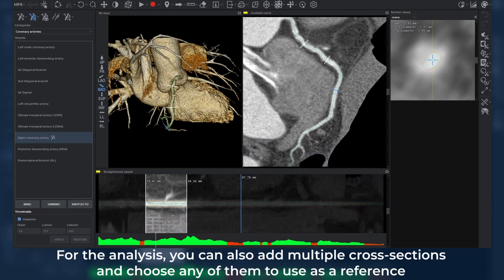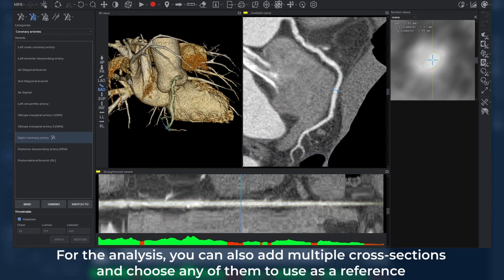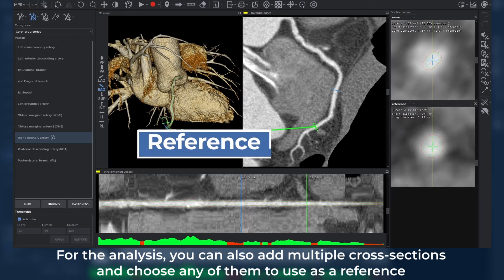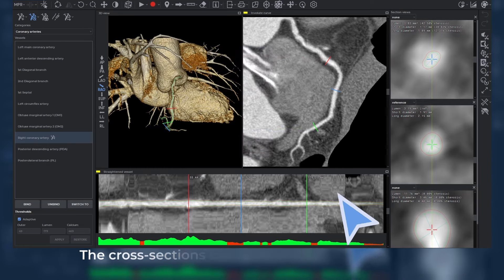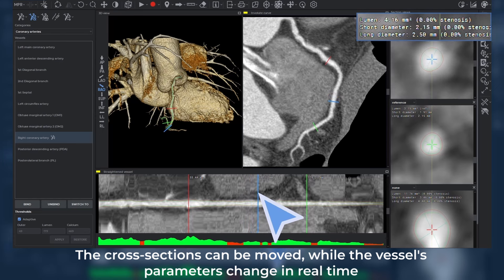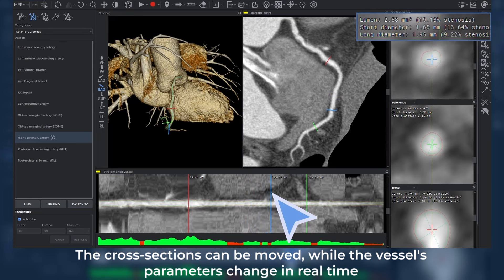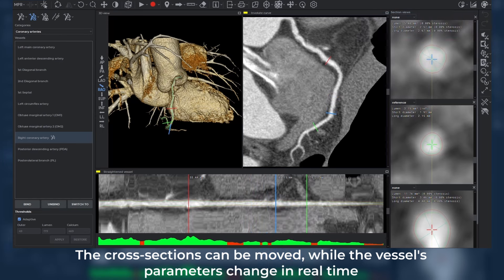For the analysis, you can also add multiple cross sections and choose any of them to use as a reference. In this case, the lumen, the short diameter, and the long diameter values contain the reference value of every added cross section. The cross sections can be moved, while the vessel's parameters change in real time.